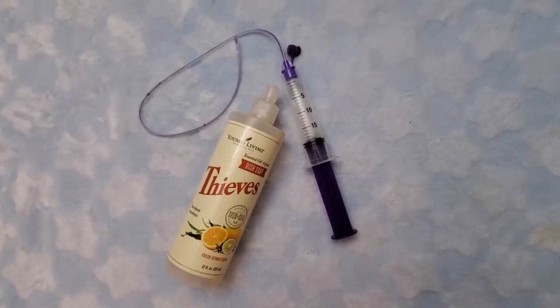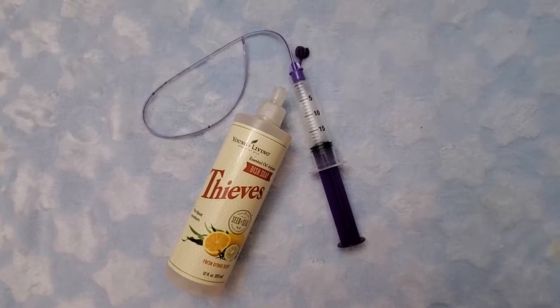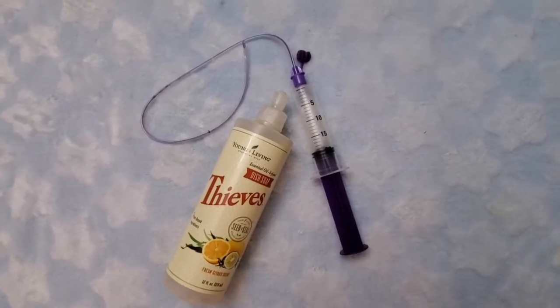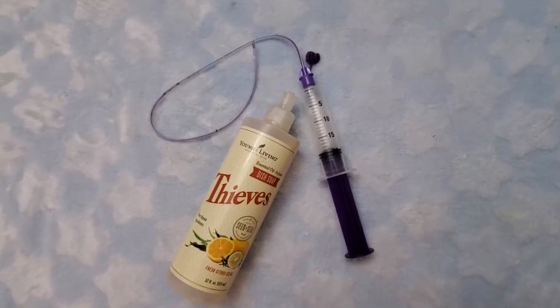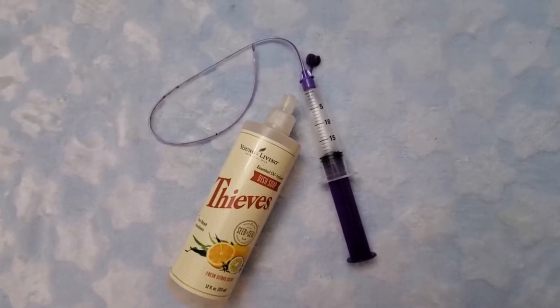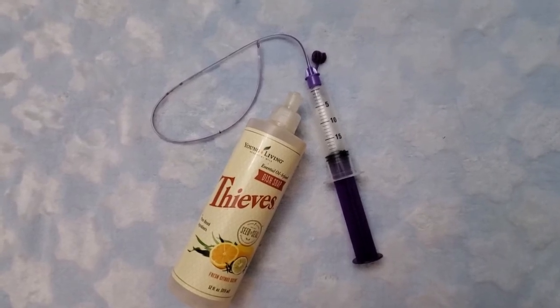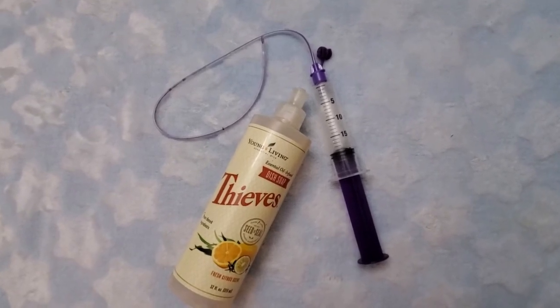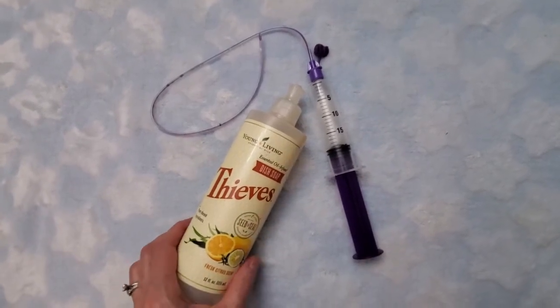Pro tip from a natural rearing dog breeder. You are looking at a tube feeding kit from the dog breeder store. These are sold as single-use tube feeding equipment. I will say however that I do cheap out — I rinse mine, clean them, and reuse them myself, but I want to show you what I use.